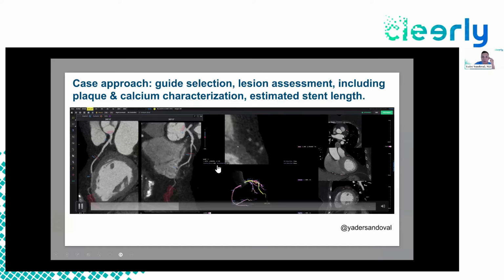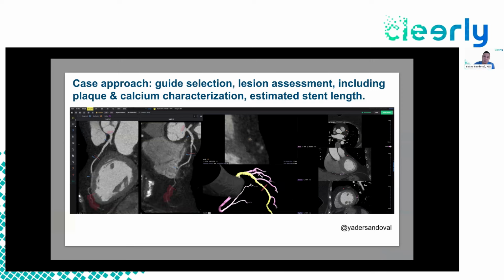And as you can see, right at this particular point, that's a 74% AI-QCT stenosis right in the middle LAD. And again, we're not level 2-3 readers. So if you're confused about where you are, you have a 3D model here with this red orbit that shows you where the problem is. So you know now that there's a mid LAD lesion. It's distal to the diagonal, and this already gives you landmarks.